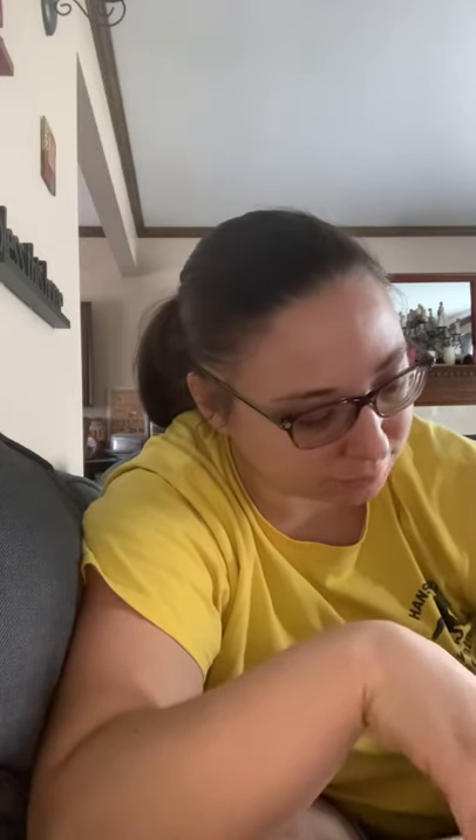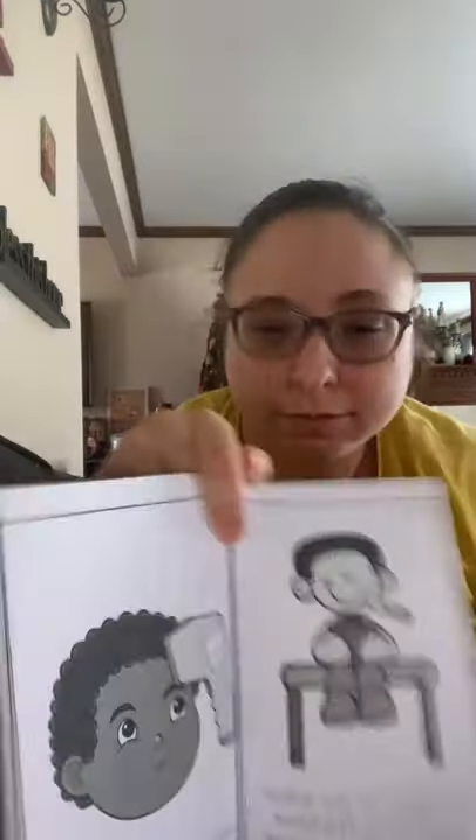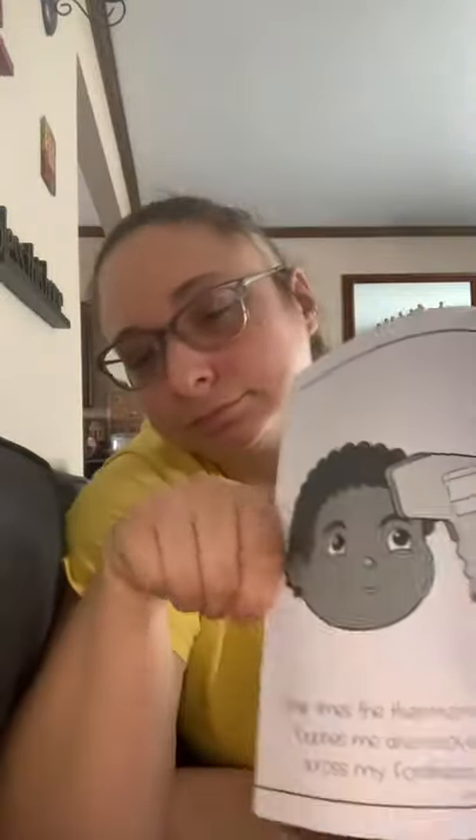Other times the thermometer touches me and moves across my forehead — like my stuff's right here, see? Still good.